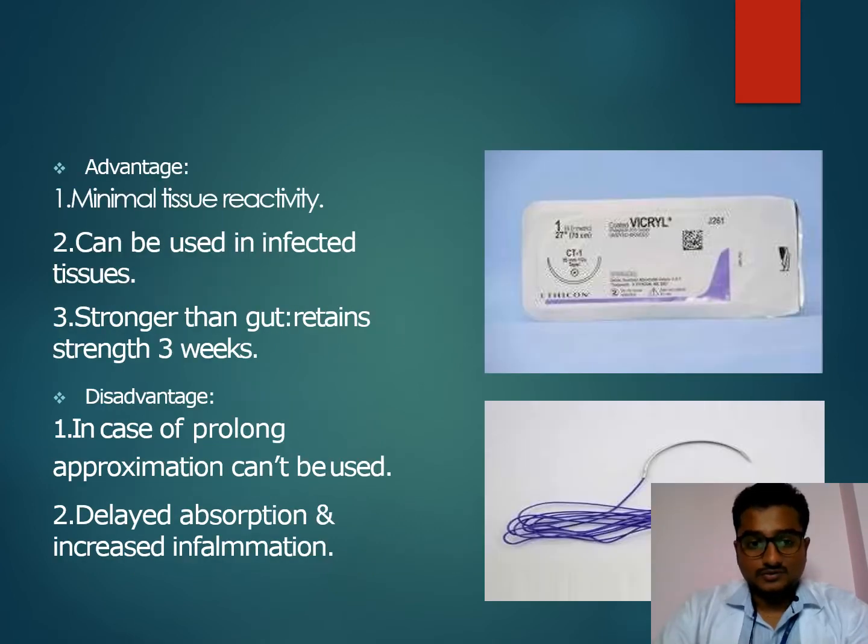Advantages of Vicryl suturing are minimal tissue reactivity, can be used in infected tissue, stronger than gut, retains strength for more than 3 weeks. Disadvantages are that in case of prolonged approximation it can cause delayed absorption and increased inflammation.